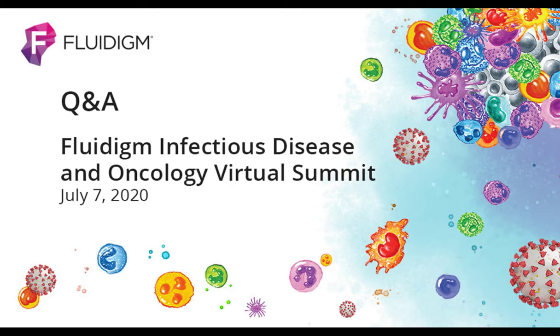So as you heard throughout this presentation, we have worked to eliminate extraction as part of this effort. And the reduction in the amount of reagents used and the number of reagents used and the control we have over our entire supply chain eliminates extraction-based supply chain issues. So those are sort of the main advantages of using saliva over nasopharyngeal swabs.